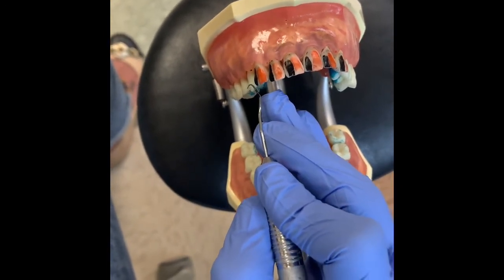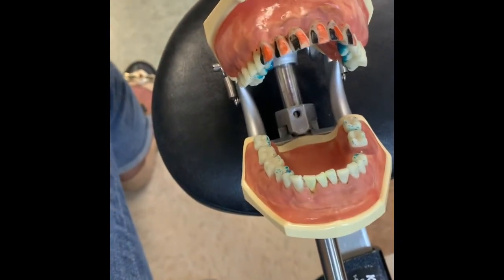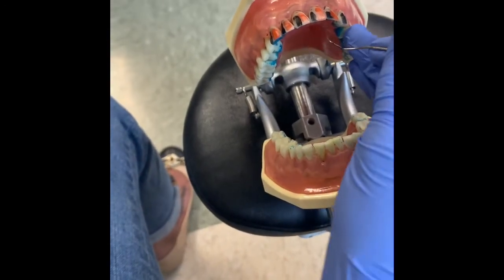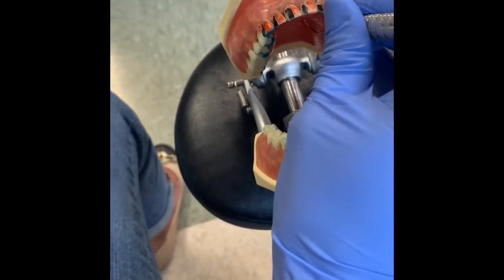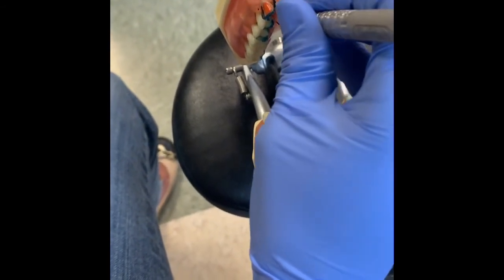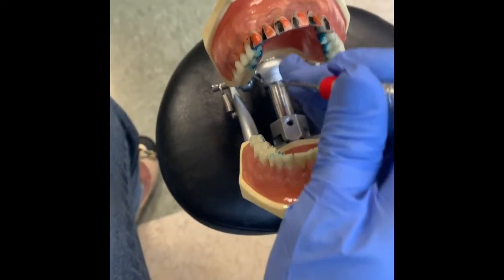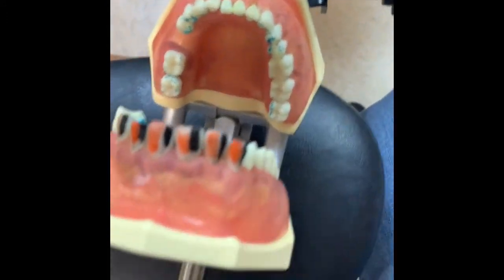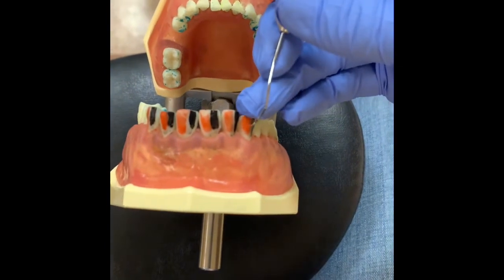I'm at 8 o'clock. I stay at 8 o'clock, grab my mirror, and now I would use my indirect vision, stay at 8 o'clock, and work at all surfaces towards me again on the lingual aspect, okay? Then I would come to 12 o'clock, switch my positions to 12 o'clock, and do surfaces away at 12 o'clock.